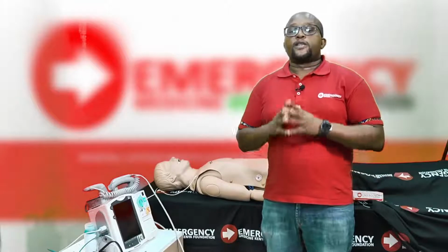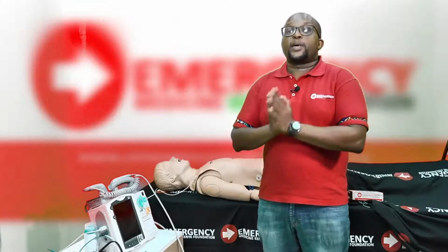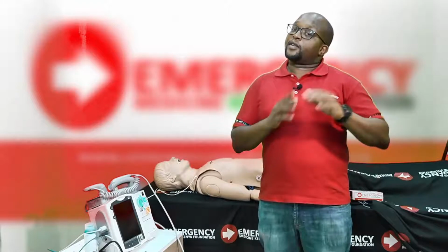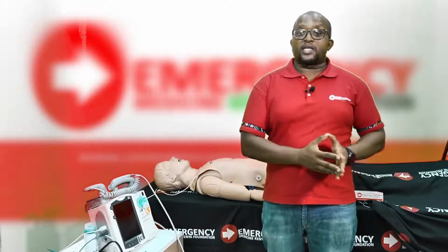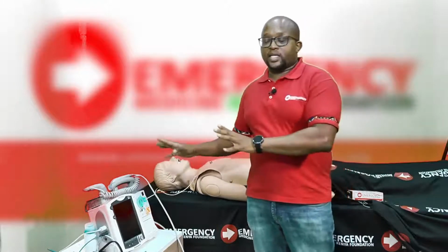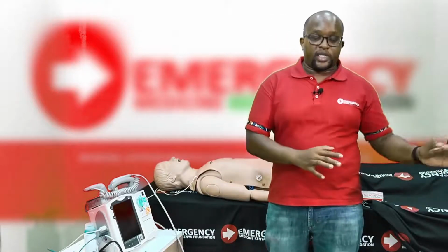Now, the first and major difference is in cardioversion, your patient is alive. They have a pulse, and potentially are talking to you. In defibrillation, your patient is not alive, they do not have a pulse, and they're in cardiac arrest mode. So that's the first major difference. Cardioversion, patient is alive. Defibrillation, patient is not alive. And you are doing CPR.